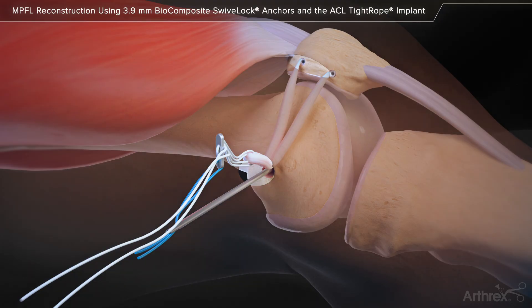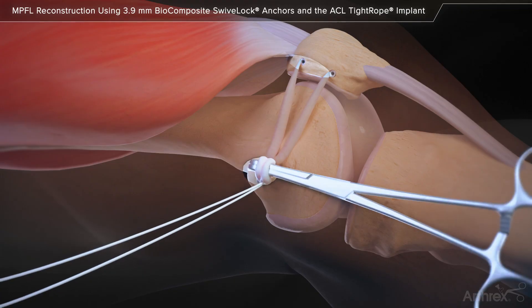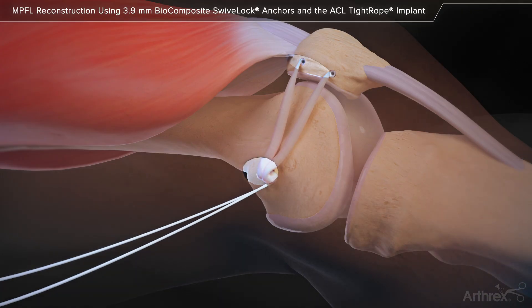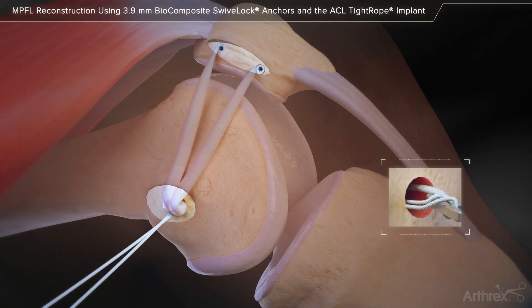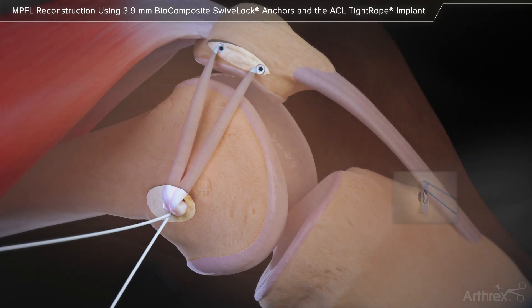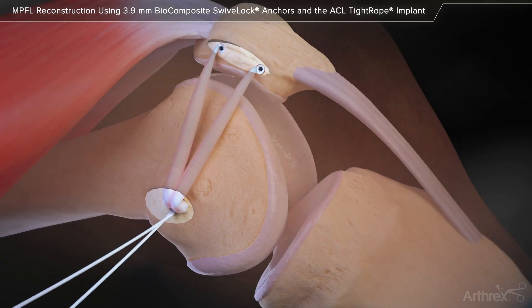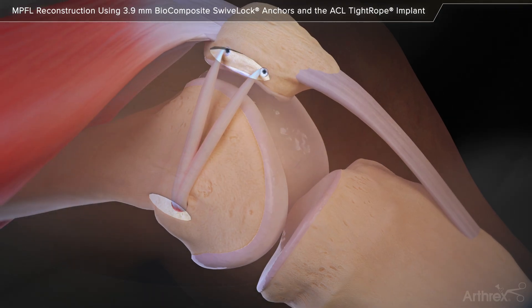Prior to the graft entering the femoral socket, use a clamp as a pulley to pretension the graft and insert it into the socket with equal tension on both graft bundles as the tightrope button is pulled through the lateral cortex. Slowly pull the tightrope tensioning sutures until the graft is pulled into the tunnel. It is very important to maintain equal tension on both graft bundles during this step to ensure proper biomechanics of the patellofemoral joint. Cut the excess suture and fixation is complete.